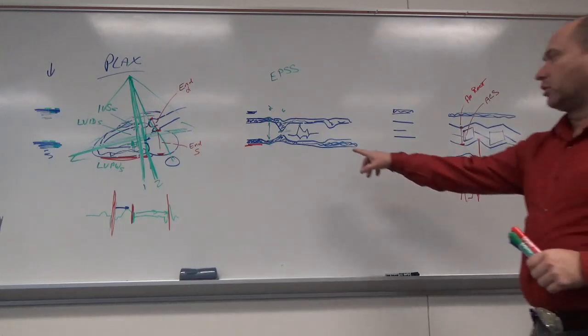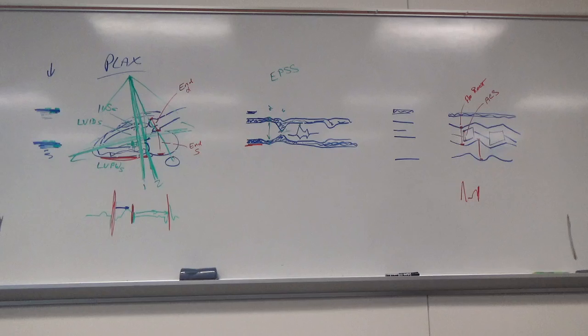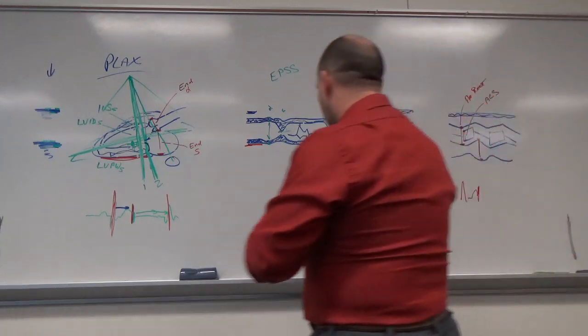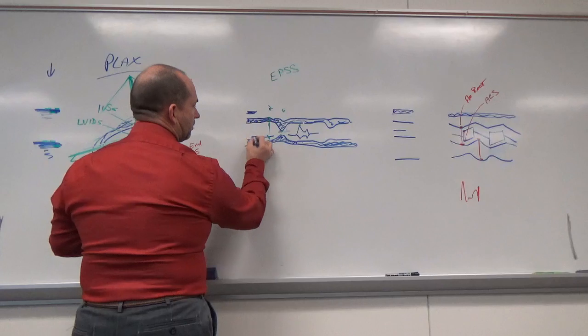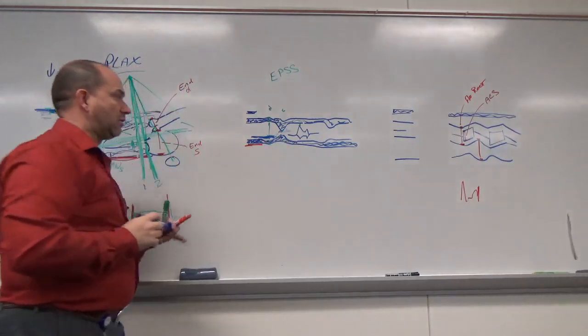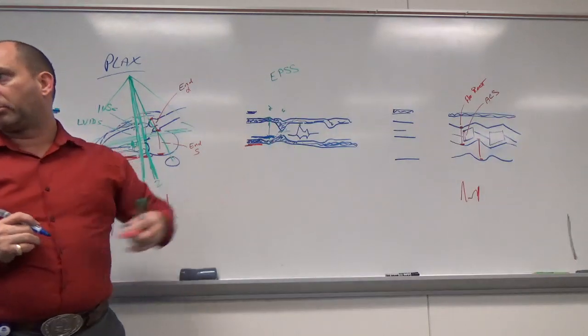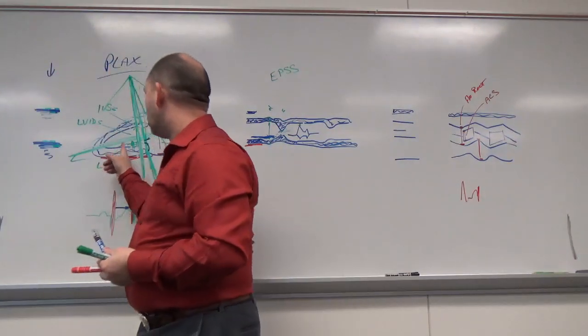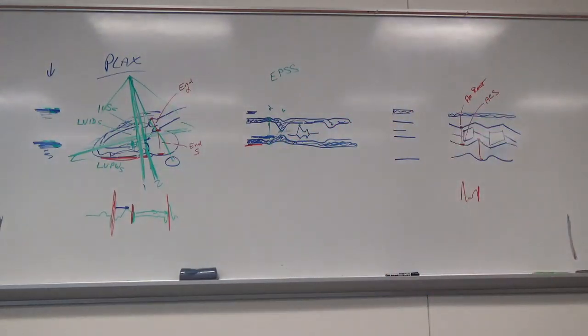In these measurements, especially in the walls, we're going to exclude papillary muscles. So if you see papillary muscles come in, you ignore the papillary muscles for the measurement. That might look like having some tissue kind of in here. You might see some chordae tendineae. You want to measure to the actual wall and ignore the papillary muscles. Same thing on 2D. If you see papillary muscles in there, go behind the papillary muscles and do not include them. Otherwise, your wall is going to look really thick.